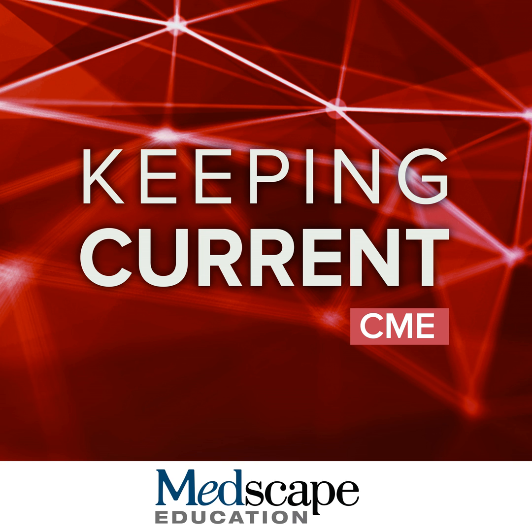severity score. So for example, for ARIA-H microhemorrhages, we want to report any microhemorrhages that were present on the pretreatment baseline MRI. These will not count as ARIA-H, but it is important that they are documented and brought forward on subsequent exams. We want to know if there are any treatment emergent microhemorrhages present on the prior exam.